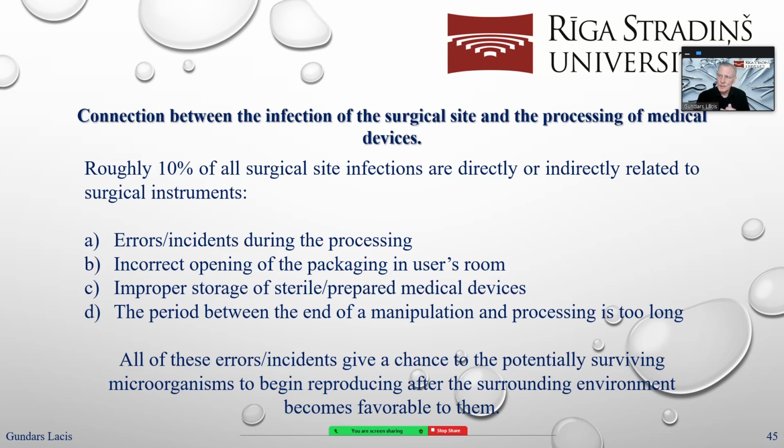Not correct opening of packages and not correct presentation. Also important is improper or wrong storage on a user site. And what is very important is the time gap between manipulation and reprocessing.